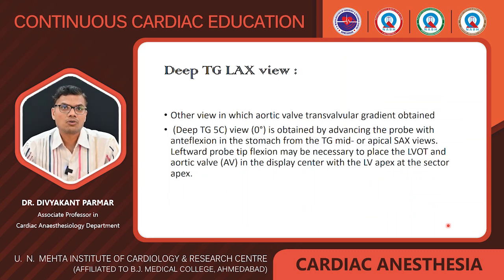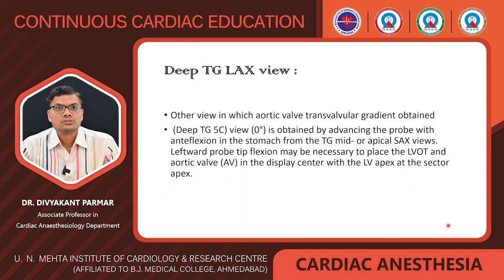Deep transgastric long axis view. We can get this view by advancing the probe further into the stomach beyond the transgastric apical short axis view, and then we have to anteflex the probe, and left side rotation may be required.